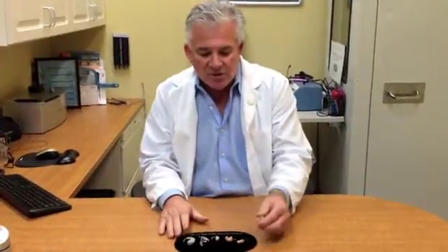The same thing with the in the canal. The in the canal, these were made for my ear. They're just mock-ups, but this is called a full shell. The full shell basically comes in here, and it's for dexterity issues for folks. And it's easy to put in, easy for them to go ahead and take out, and they can feel it and know what it does.